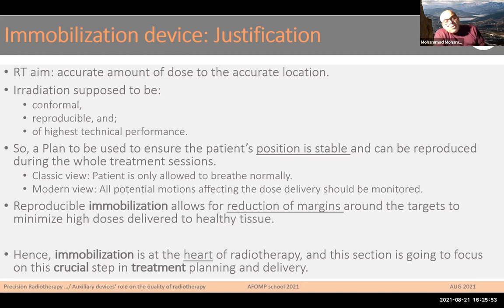Immobilization, in other words, we can say, is one of the important sections that comes from accurate location, meaning that it can be nominated as the heart of radiotherapy. And this section is going to focus on the crucial step of treatment and delivery.